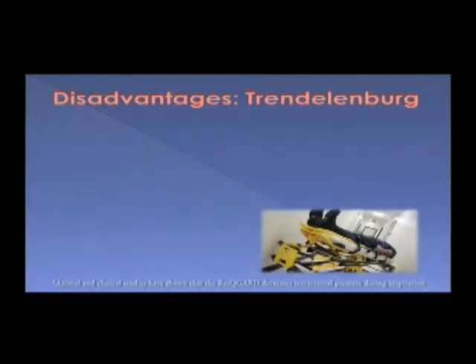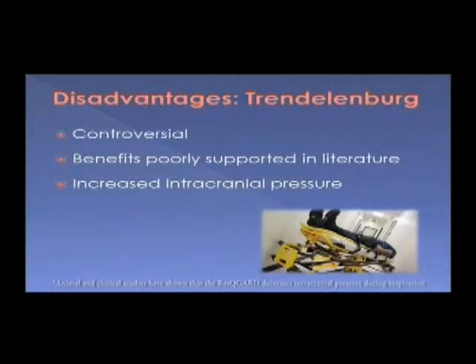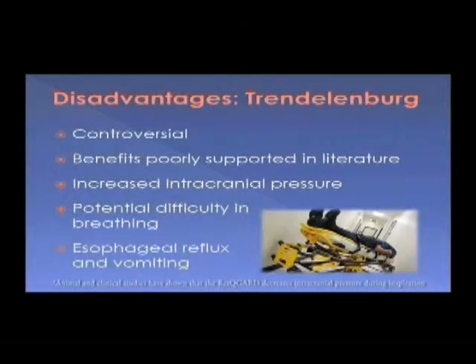First, we'll look at a position change, such as Trendelenburg. Use of the Trendelenburg position has been controversial, in part due to the fact that there is not much clinical data that support its use. While this position may temporarily increase blood pressure, it also raises intracranial pressure. The ResQguard increases blood flow while decreasing intracranial pressure. Often, it is more difficult for the patient to breathe. And finally, there is an increased risk of esophageal reflux and vomiting.